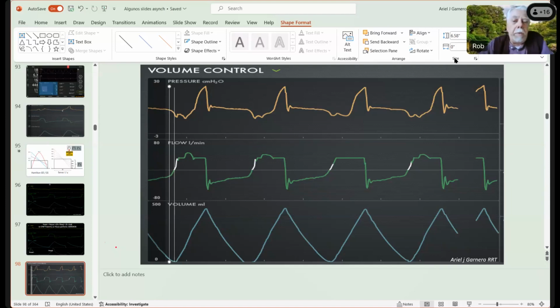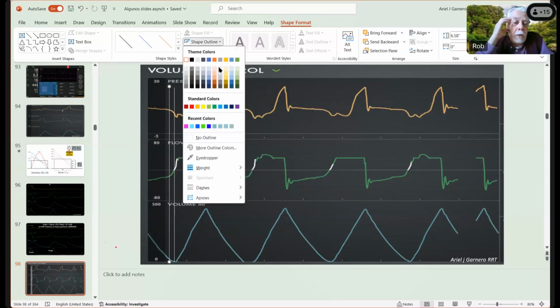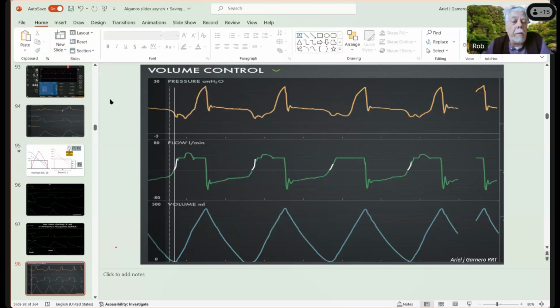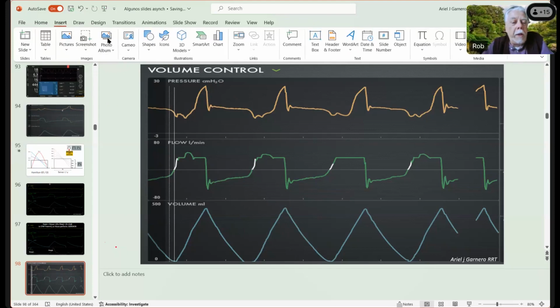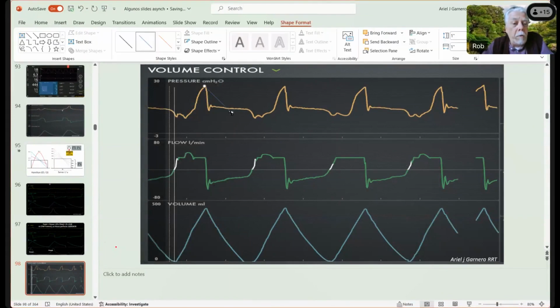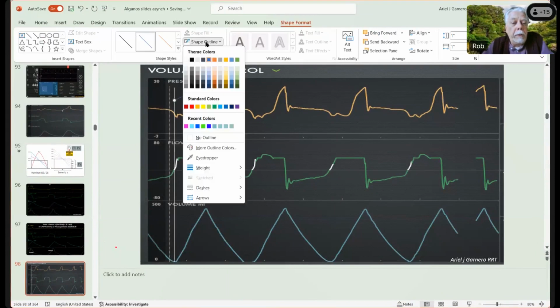On the other hand, you could argue, well, the ventilator's triggering normally. It's probably a very good flow trigger sensitivity, and no matter how sensitive you set the ventilator, it's not going to trigger any faster because the patient has a lot of expiratory flow at the time he's making an inspiratory effort. Then you could say, well, if you had an esophageal pressure catheter, you would see that the patient effort happens first. And if you put the patient on NAVA, that triggering delay might go away. So I suppose you could argue it either way.